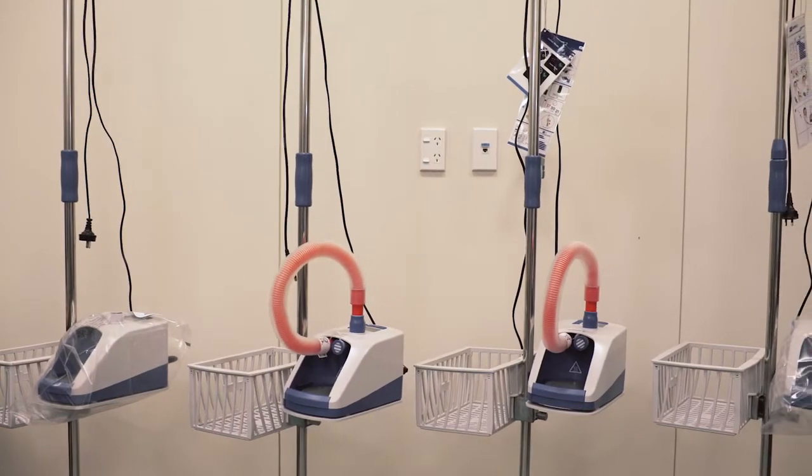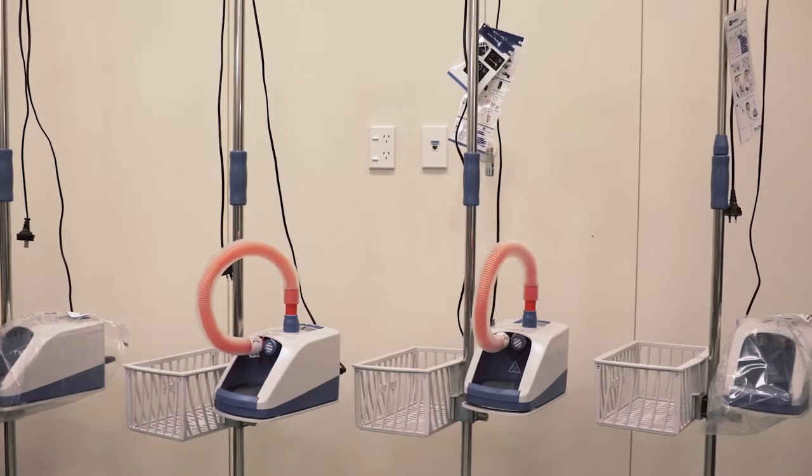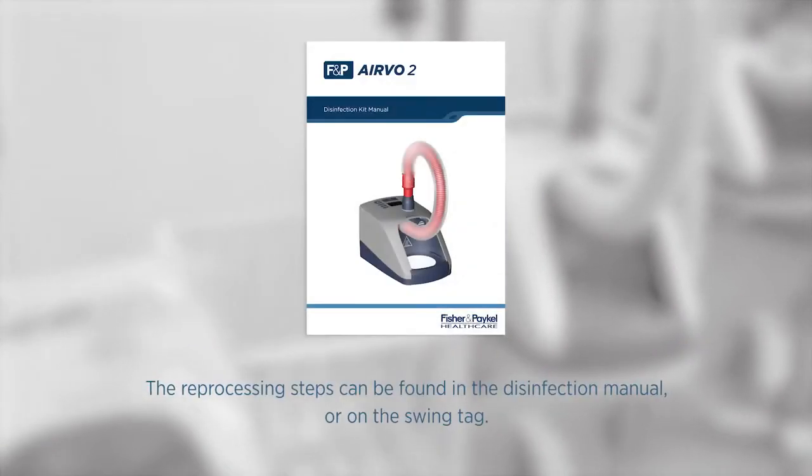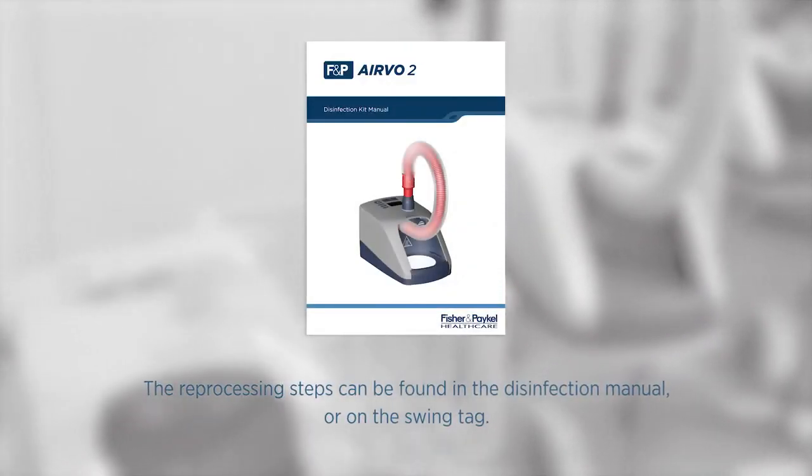The Evo2 must be cleaned and disinfected between patients. This should take place as soon as possible after use. The reprocessing steps can be found in the disinfection manual or on the swing tag.